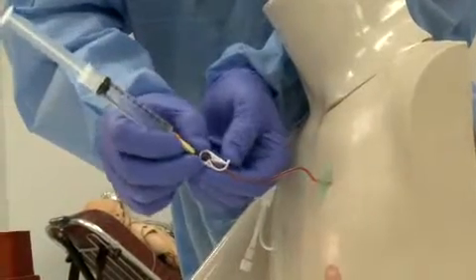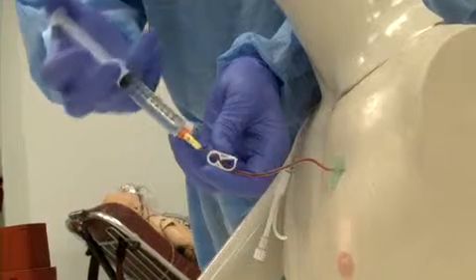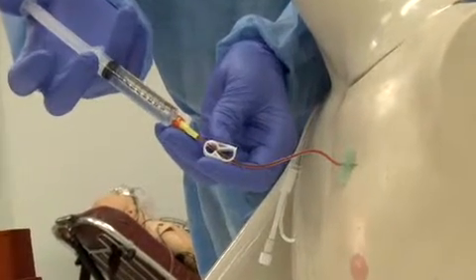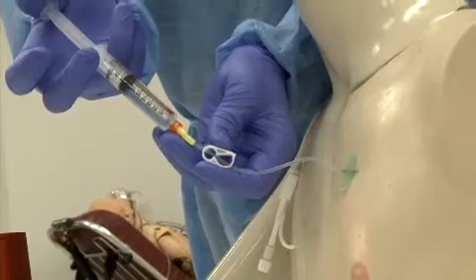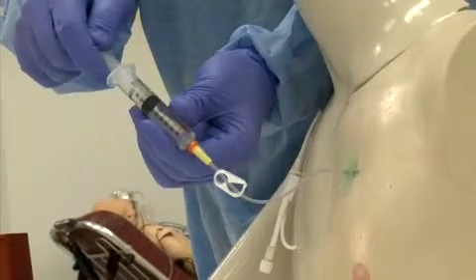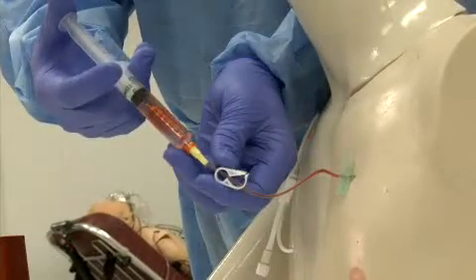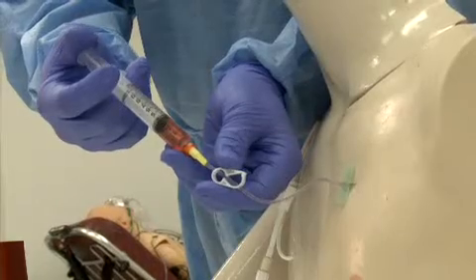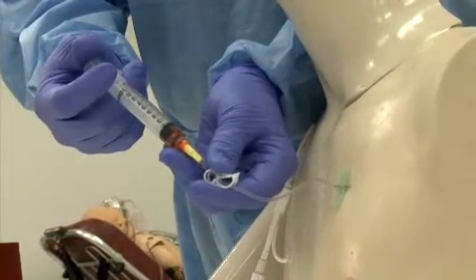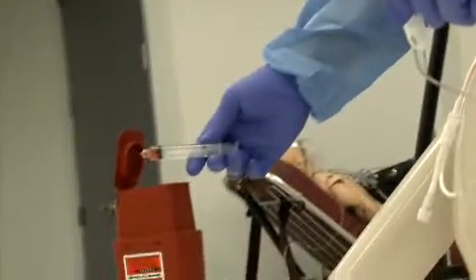Open the clamp and infuse a couple of cc's of saline. Withdraw to ensure the line is patent, and then continue to infuse the saline, leaving 2 cc's in the syringe and closing the clamp before releasing the plunger. Remove the syringe and discard safely in a biohazard container.